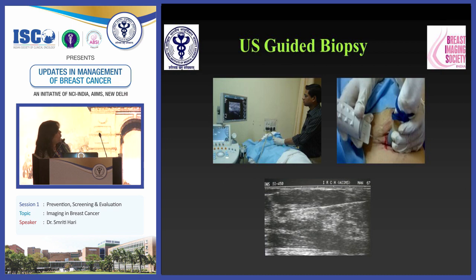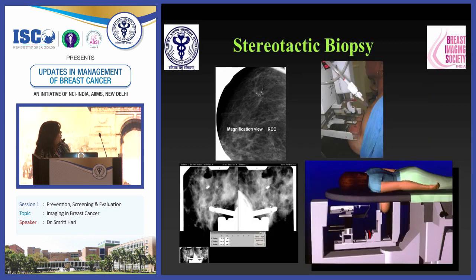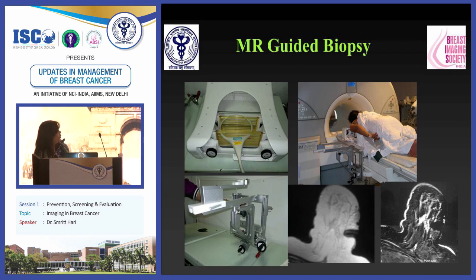Now the type of imaging modality that you would use for guidance would depend on the case, which is the best modality showing the lesion and how comfortable you are with it. So most of the cases are done under ultrasound guidance. However, sometimes you need stereotactic biopsy for mammography-only findings, especially microcalcifications, or rarely MR-guided biopsy when you can't see a finding on ultrasound or mammo, even on second look, and it's an MR-only finding.